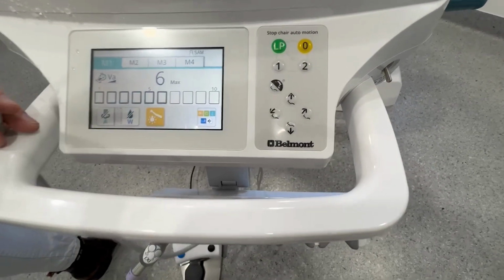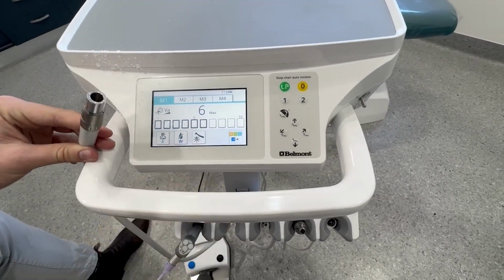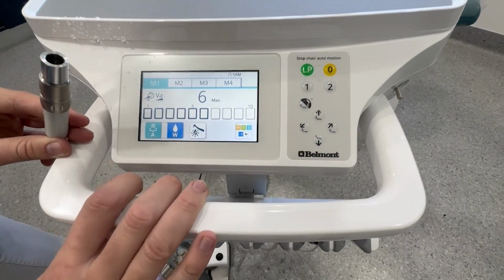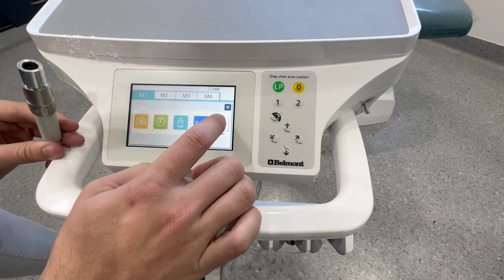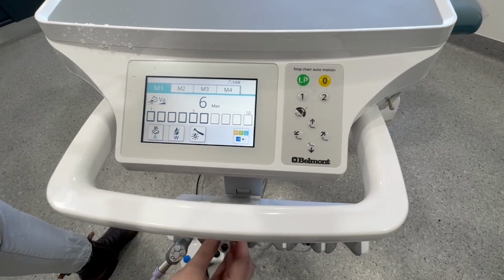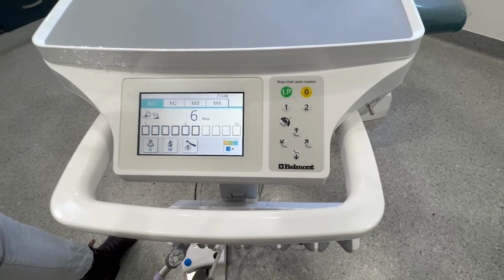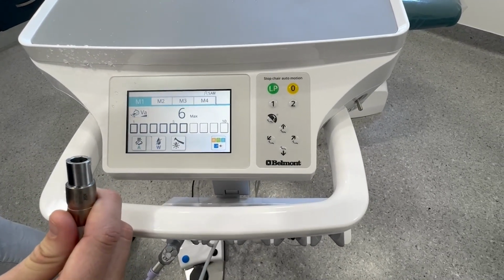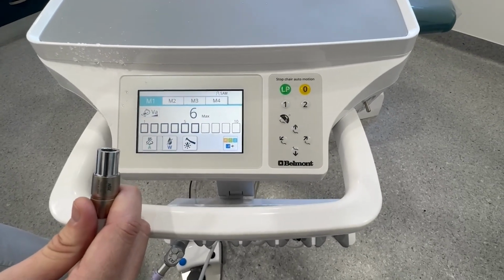And then down the bottom of that, we've also got our optics on and off light there, you can see. Optics on, optics off. Water on, water off, and air on, air off. Now, our mode that we went through before, at the moment, air and water are both on and both off. Or we can change that through to 4 mode, which means you can have air on and water off, water on and air off. Now, when we're talking water and air there, we're talking our mist air, our chip air. So that's what gives us our water spray. We've got our jet of water coming out, that mixes with air, and that gives us that nice little mist. They're the things that we're controlling on that touch panel there.